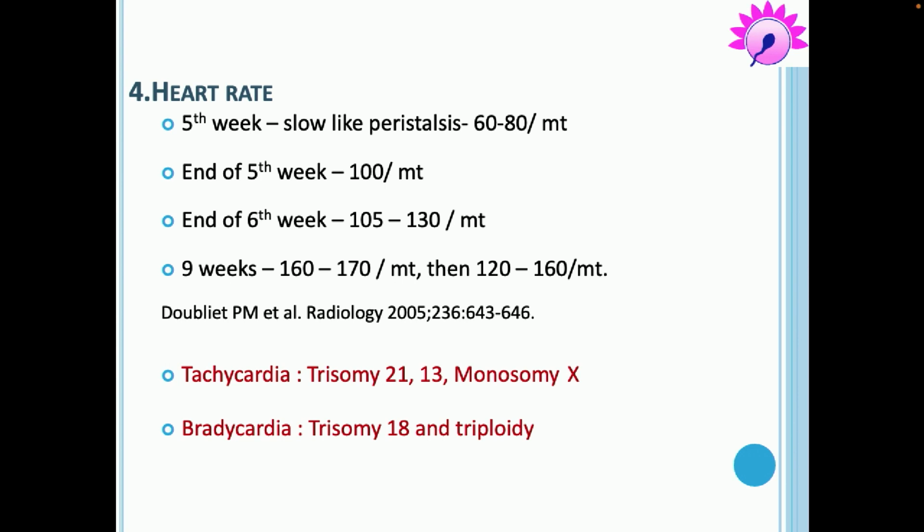Heart rate, we know that the heart rate starts as very feeble pulsations. At the end of 5th week it is like 100 per minute, end of 6th week 105 to 130, 9 weeks 160 to 170, and then settles at between 120 and 160.